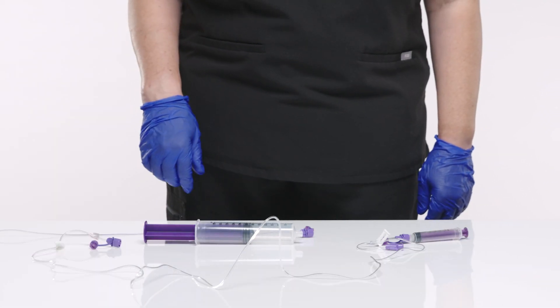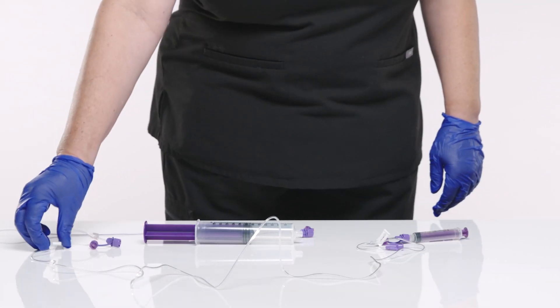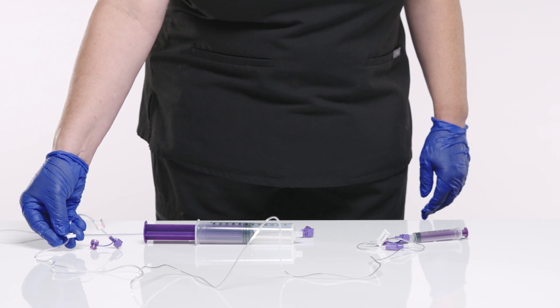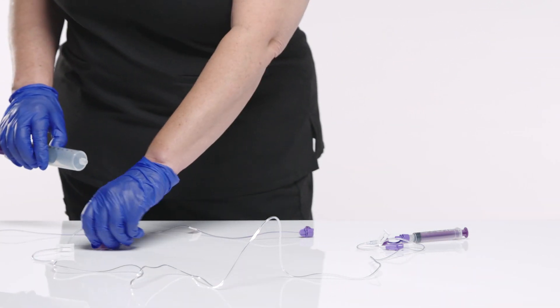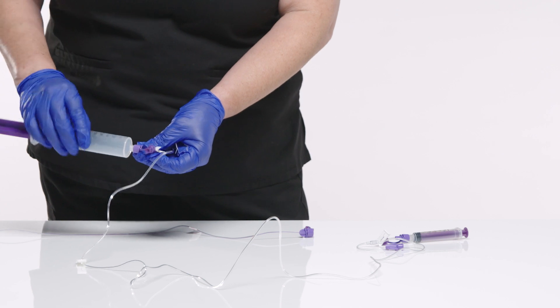Make sure the extension set is not clamped before connecting to the EnFit syringe. Connect the EnFit syringe to the male EnFit connection at the distal end of the extension set.